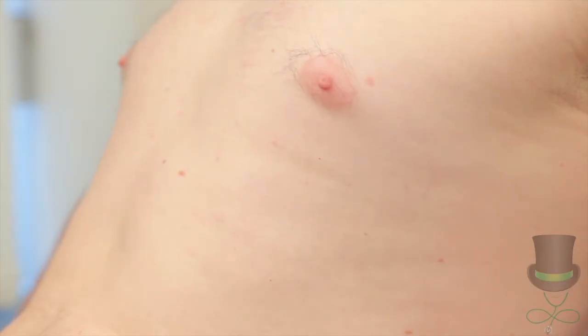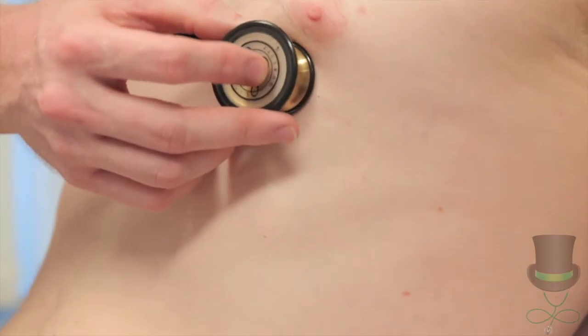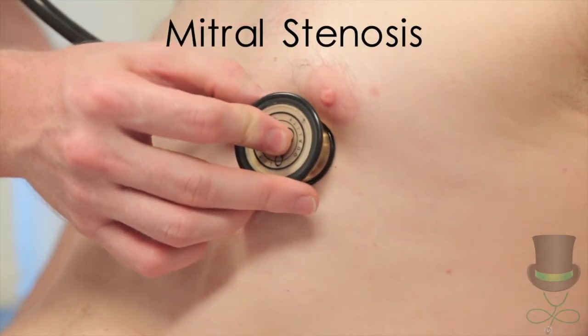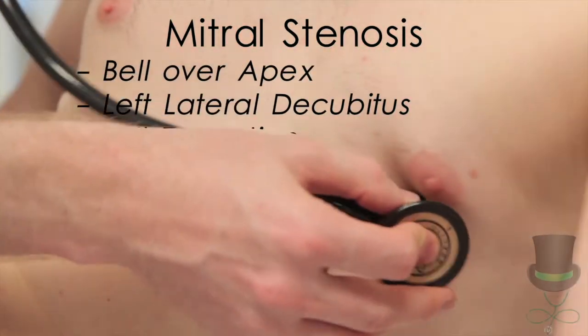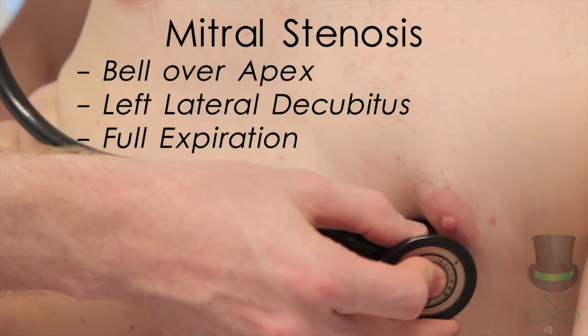So I'm going to get you to do that again — take a breath in, then let it out all the way and then hold it out. For mitral stenosis, place the bell on the mitral area and move the patient into the left lateral decubitus position in full expiration.